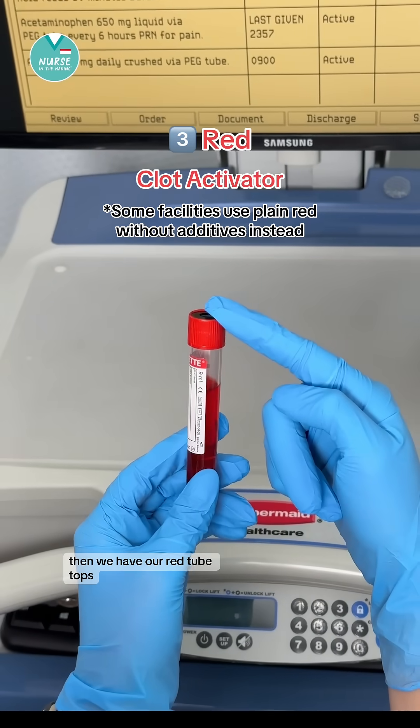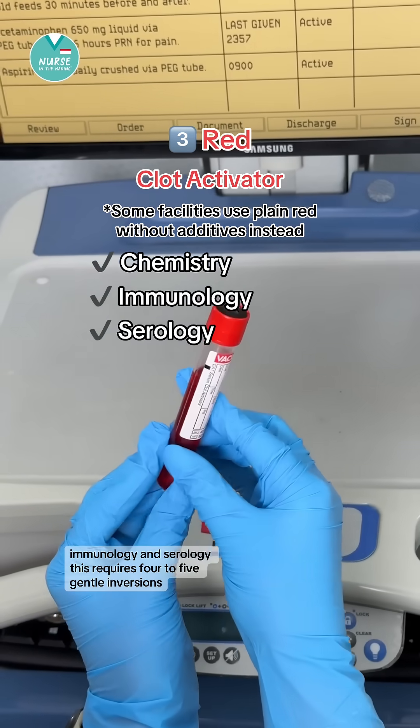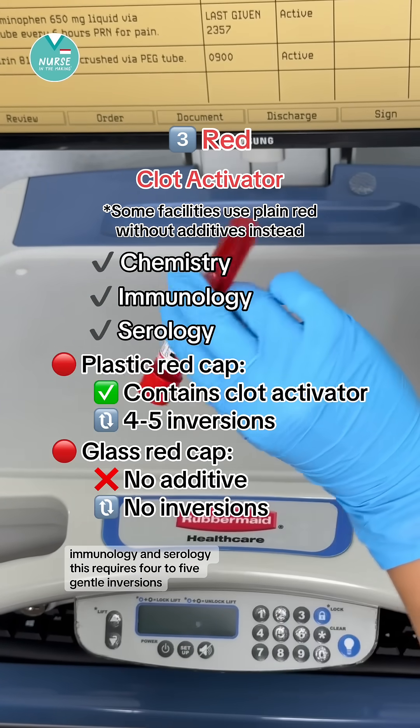Then we have our red tube tops, or clot activator. This is used for chemistry, immunology, and serology. This requires four to five gentle inversions.